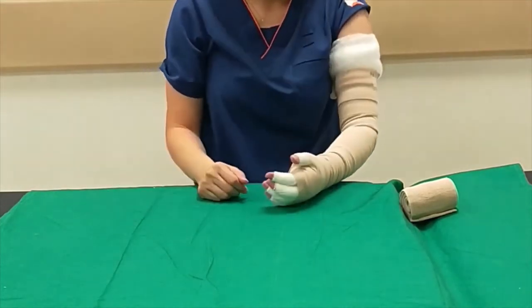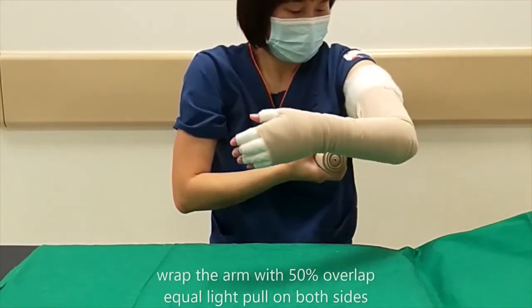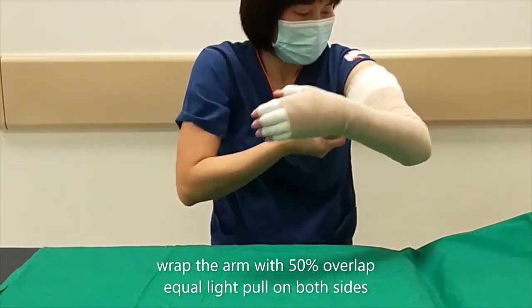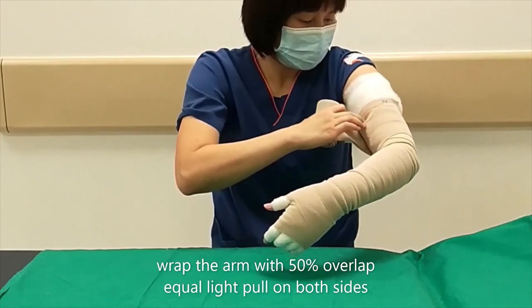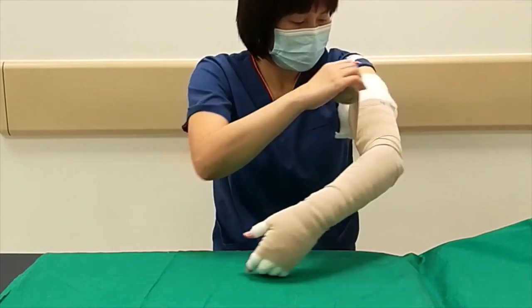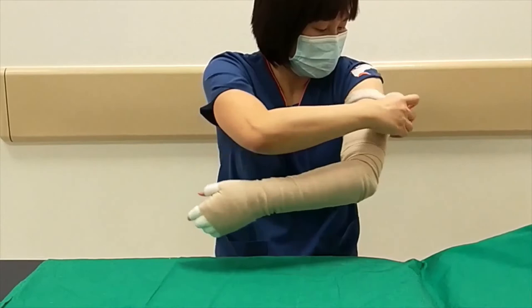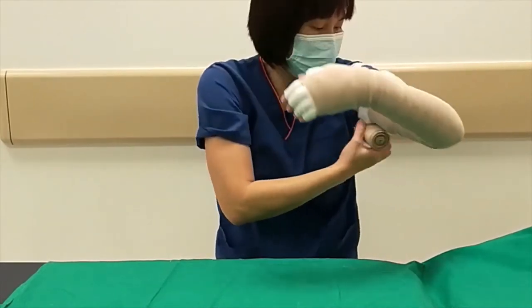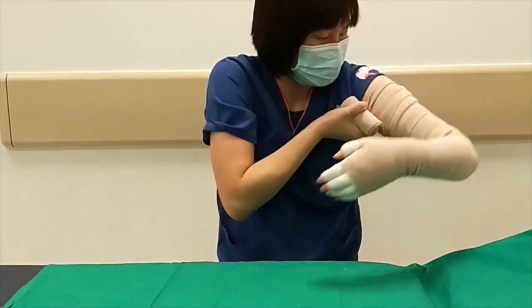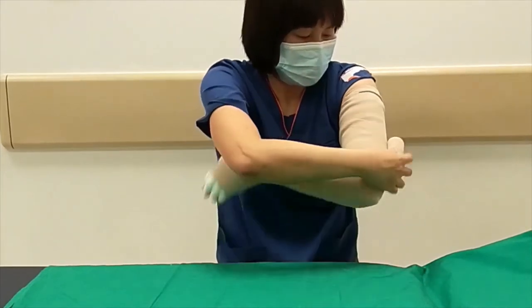A wider short stretch bandage the length of the arm is then used on the arm, overlapping 50% with the same light tension on each turn, with light pulling on both sides. If there is any excess, lay down the bandage without any tension.